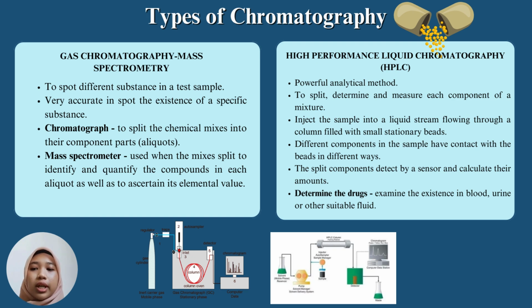To determine the existence of drugs, we must examine the blood, urine, or other fluids to help us know the amounts of drugs in the body. Below on this slide, you can look at how the process of HPLC works and looks like.